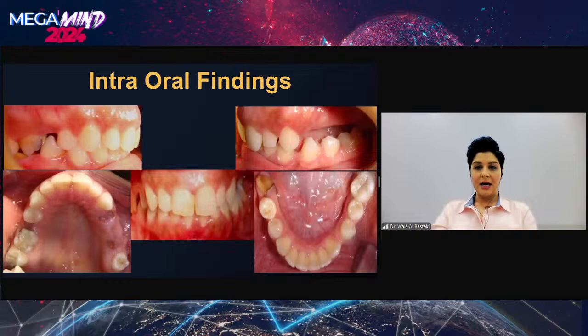Here are the intraoral photos of the case. At first look at the photos, you notice how challenging the case is, mainly from the prosthetic point of view, because the interocclusal space between the arches is very limited. So this is something very important to consider. Putting an implant without being able to restore it properly is useless.